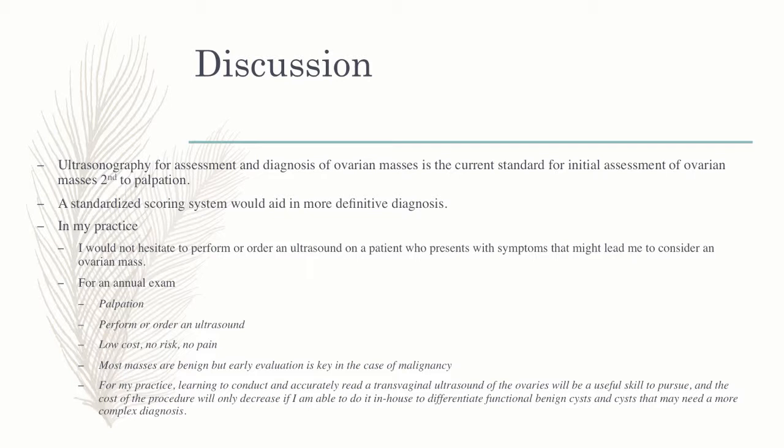For my practice, learning to conduct this test accurately and to read the image will be a really useful skill to pursue. And the cost of the procedure, if I have my own machine, will decrease if I'm able to do this in house. And be able to differentiate at least those early stages, the simple ones, whether I need to refer or just watch or come back even here. So this would be a really, really useful skill to be able to interpret this test.